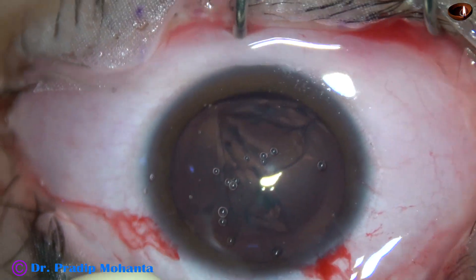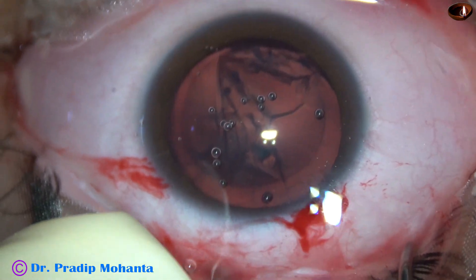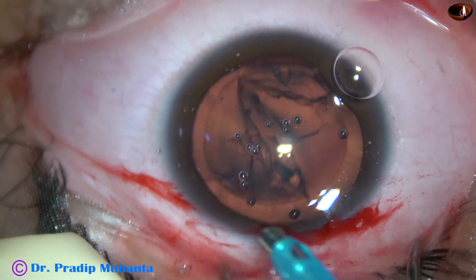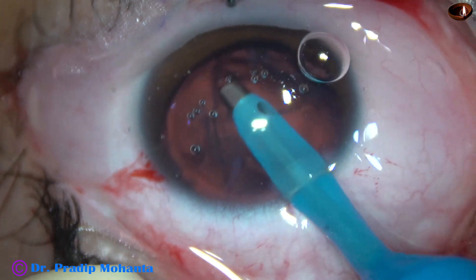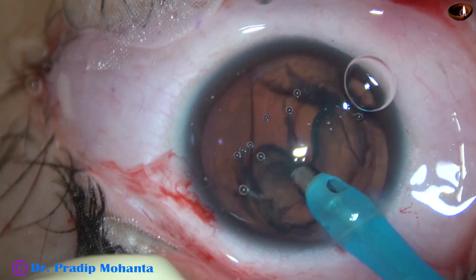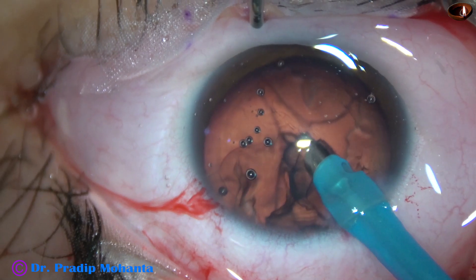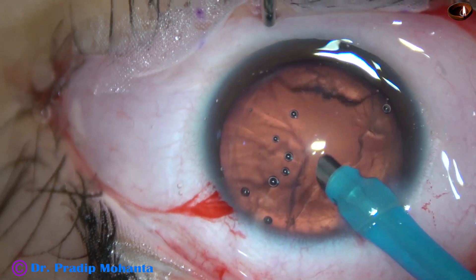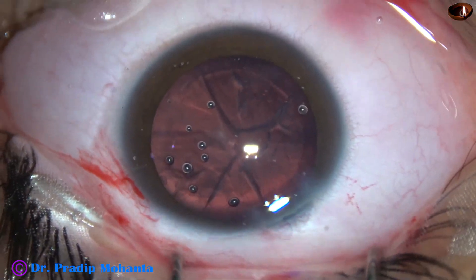Now some more viscoelastic is added. We just have to use a bit of vacuum and aspirate the lens mass — we don't have to use any ultrasonic energy in this case. Here goes the FACO probe with bevel down, with 400 mmHg of vacuum and a flow rate of 40. The lens mass is aspirated.